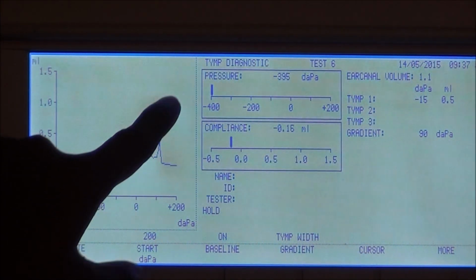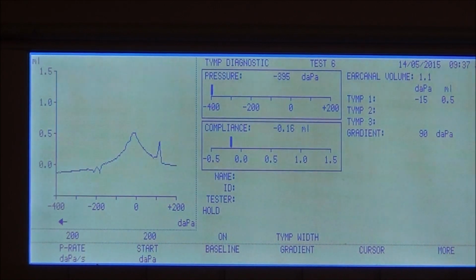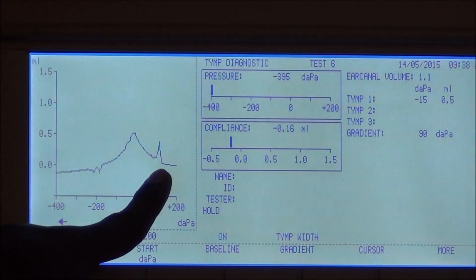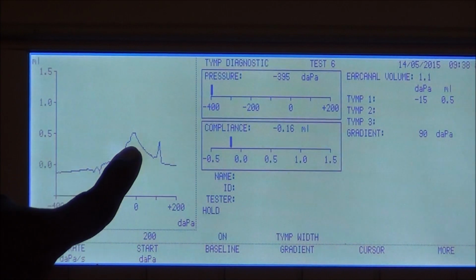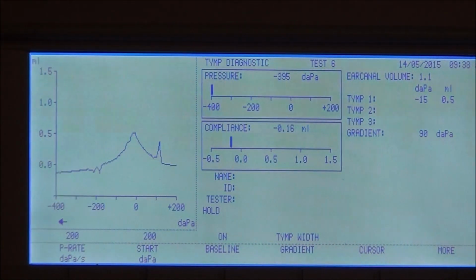In case this is taller than the peak compliance, then it will consider that as peak compliance. So it uses only one method, peak picking. So in your graph, you might very well know that this is an artifact and your peak compliance is somewhere down there. But still, if you read only the values, then you will be biased by writing the wrong values. In the sense, you will be plotting the artifact compliance rather than the original.